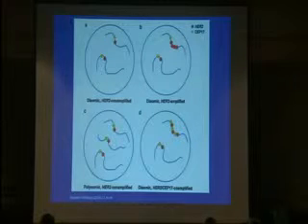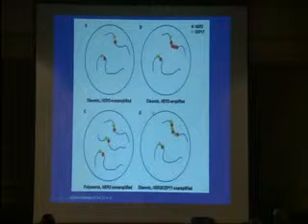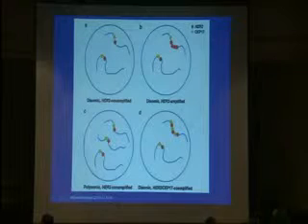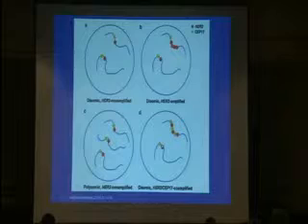But we actually have amplification of the HER2. We have 1 chromosome with 3 copies of HER2, that's amplified. Also, we see the amplification of the CEP17, the green dots. So these are the patients that we can potentially miss amplification in. We'll get a normal ratio, a ratio less than 2, but we are going to miss the true amplification here. So this is the problem with polysomy 17, that these patients are going to be missed if we only rely on the HER2 to CEP ratio.